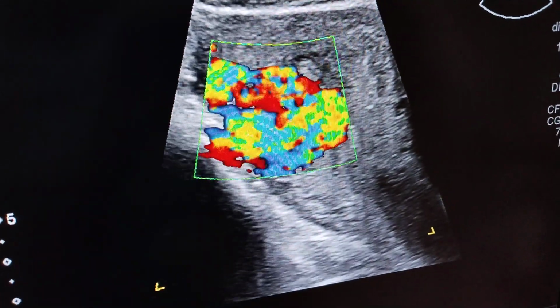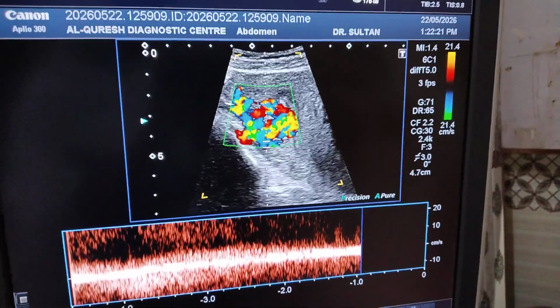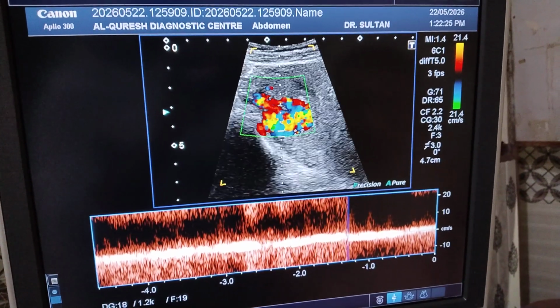So now I'm going to see the velocity of these channels.